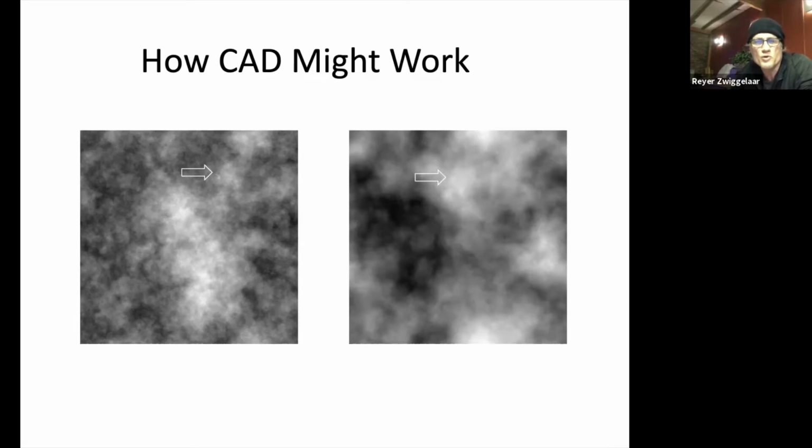Radiologists, clinical experts might be able to deal with this if it's at this level, but if a radiologist sees something like this, then the CAD system is not very useful to them, and it might even distract them from finding the right thing. Because they would spend a lot of time interrogating different areas in the image that they don't need to look at.